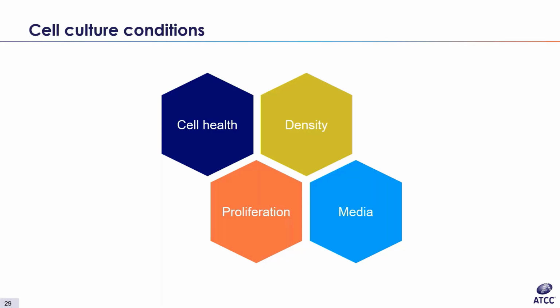Contamination can lower the observed transfection efficiency, especially if it's mycoplasma. If you ever observe a drop in efficiency with a transfection protocol that has been previously optimized, mycoplasma contamination may be a likely reason. Media used during the transfection process is also a consideration. Certain lipids require no or low serum during the transfection process, so always follow the lipid manufacturer's guidelines.